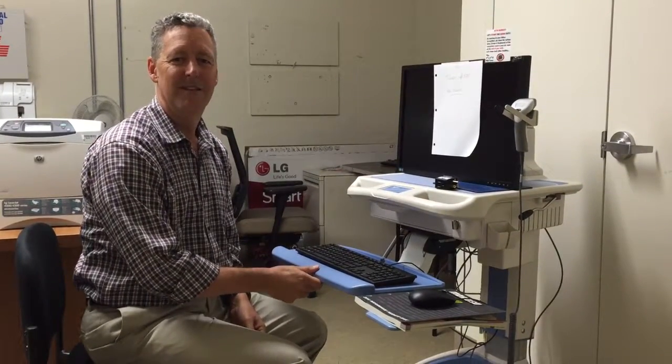So that is how to use a workstation on wheels. It can be a very effective tool for working with patients. Thank you very much.